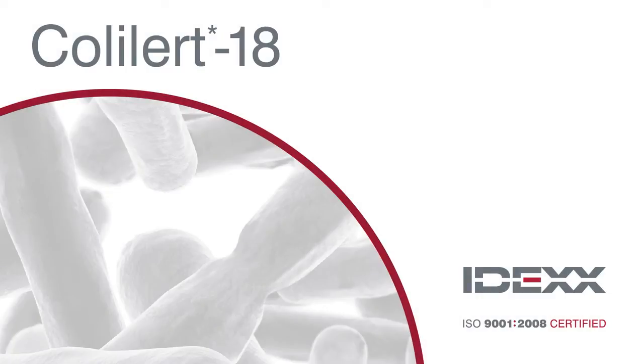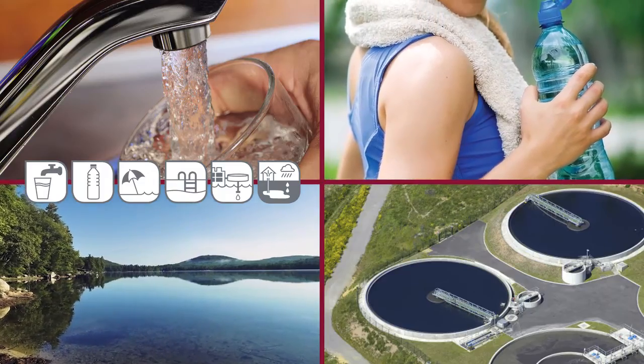The IDEXX ColAlert 18 test simultaneously detects both total coliforms and E. coli in multiple water types in just 18 hours.